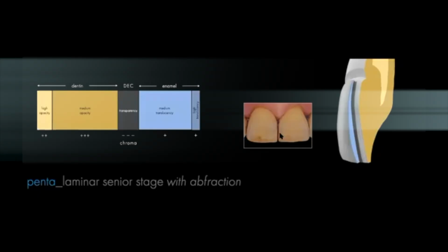You know, it's a bit weird, but our model of layering is a bit more like a zombie, right? We are not using a normal person. We are using someone with problems, with a deteriorated situation, with decay. This is not a normal model. This is a pathologic model.